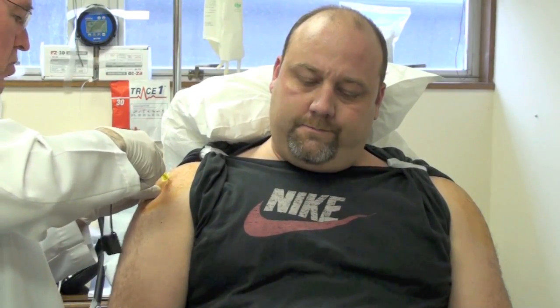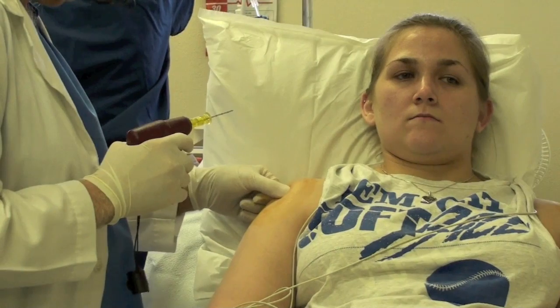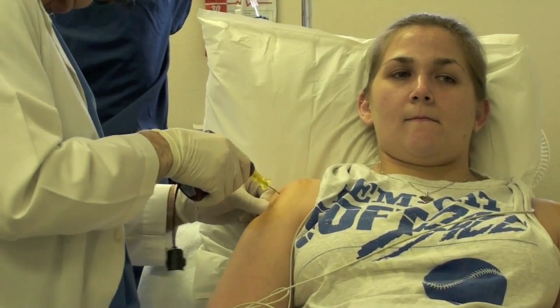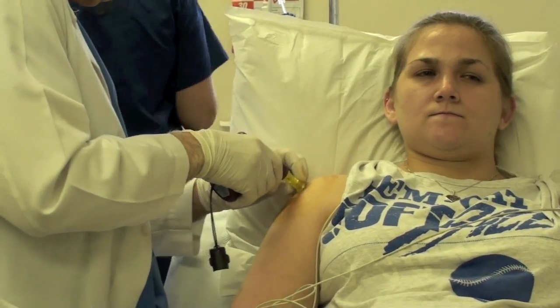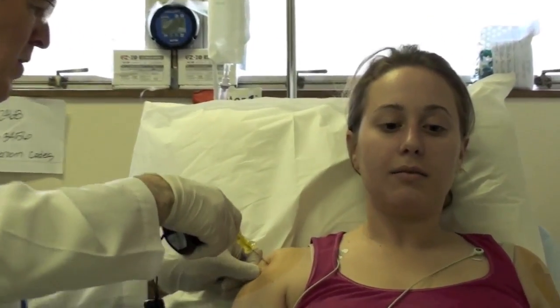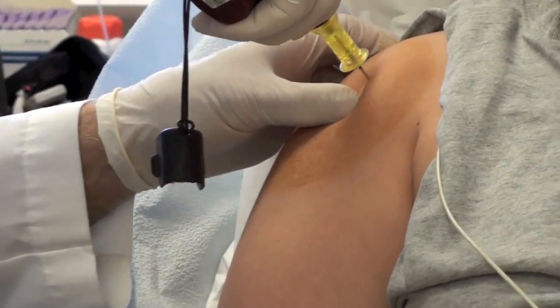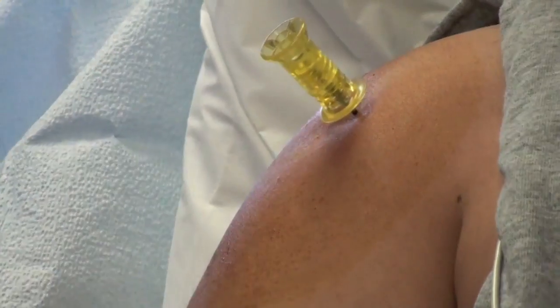Now it's going to be a count of five. One, two, three, four, five. The next one is going to be about a count of four. One, two, three, four, five. One, two, three, four. About three — one, two, three, four. One, two, three, four.